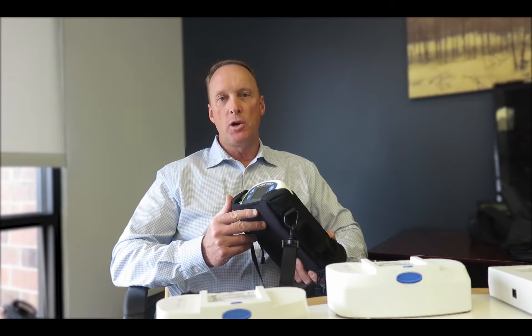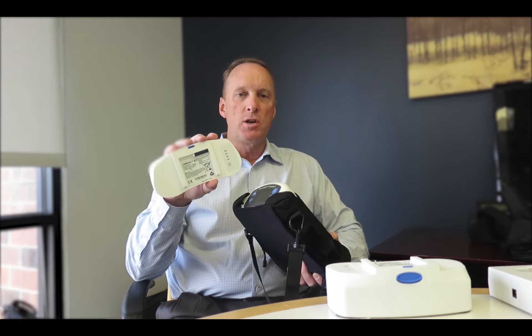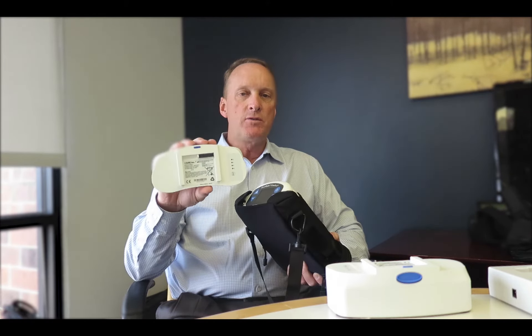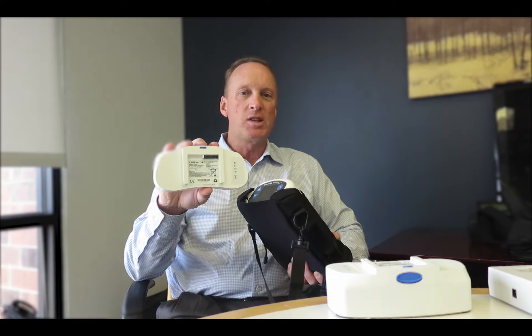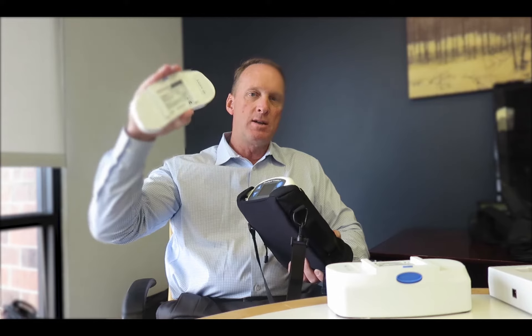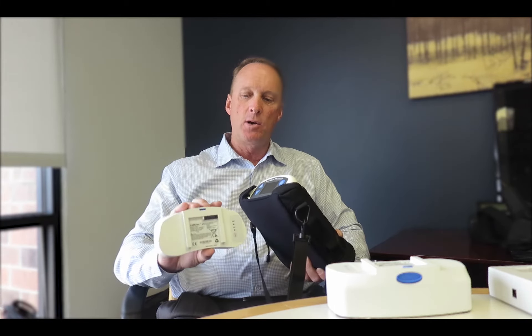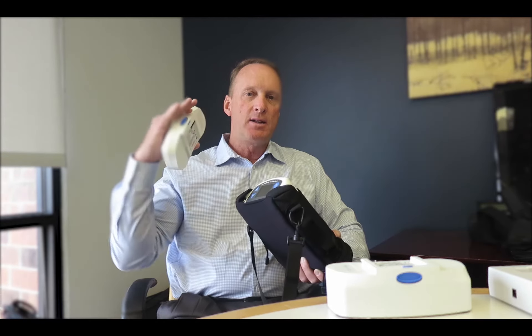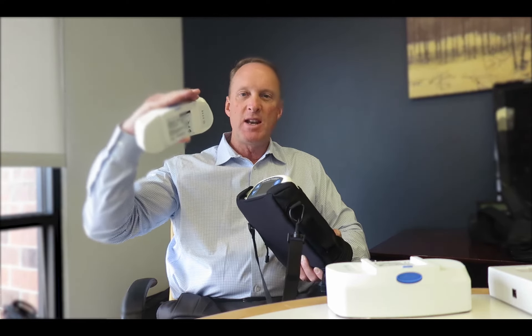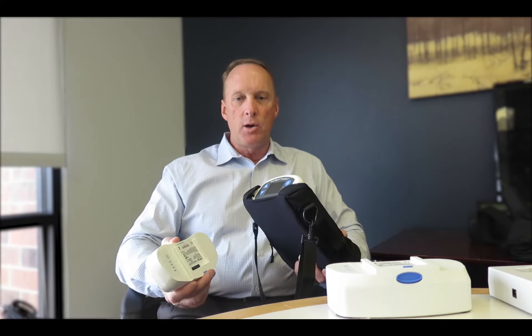The second feature is to be able to understand how many battery cycles the battery has been charged and recharged. All batteries, for the most part, for all POCs will last about 300 full cycles, which means 100% down to zero and then back to 100% again. That would be one full cycle. Most patients will use batteries by taking them from 100% maybe down to 80% and then recharge it, which would only be one fifth of a cycle.